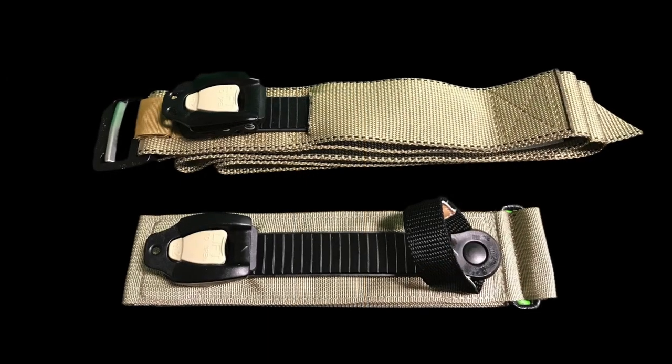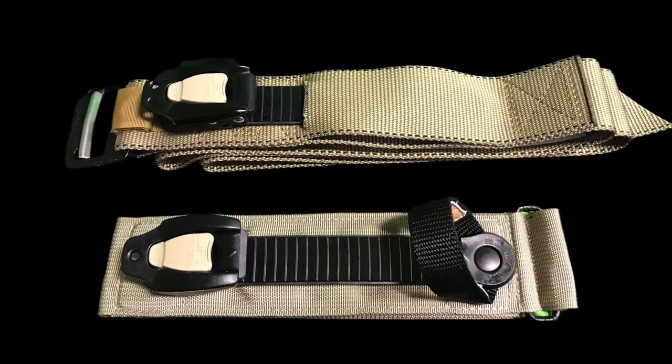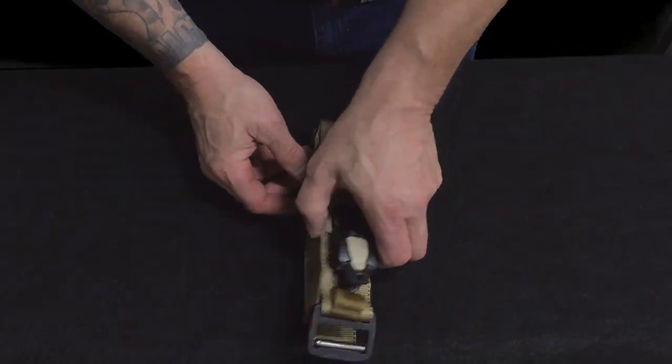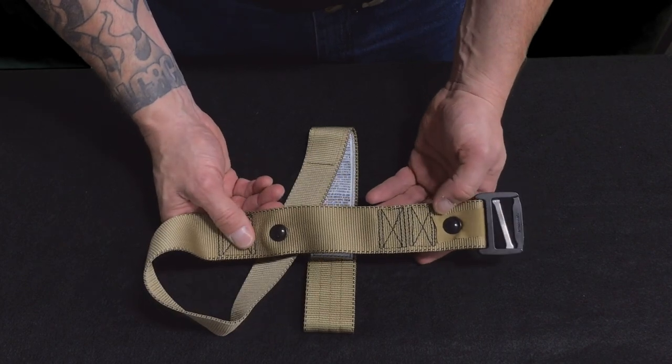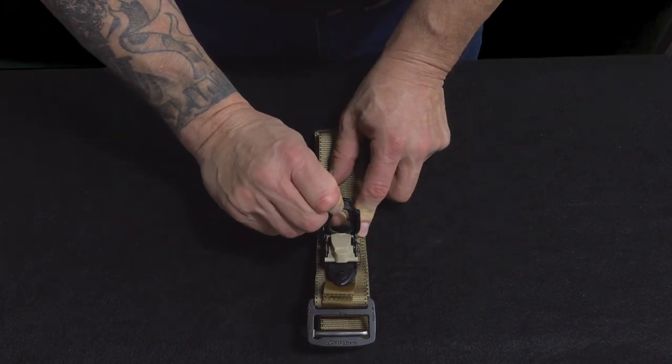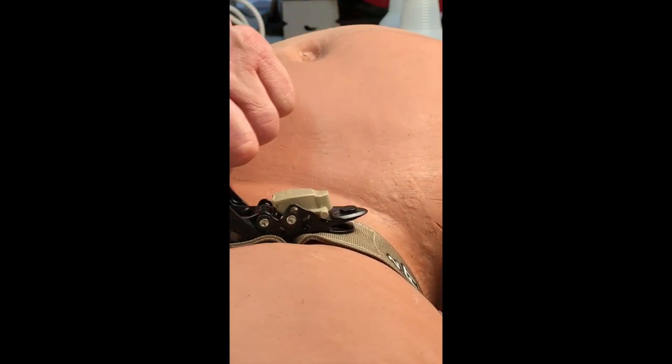Parabelt uses the same tightening system found on the TCCC recommended TX2 ratcheting medical tourniquet. The ratchet and ladder are secured to the webbing with steel grommets. The ladder passes through the ratchet assembly and is tightened by lifting the lever arm on top of the ratchet, which moves the ladder and auto locks with every rotation of the lever arm.